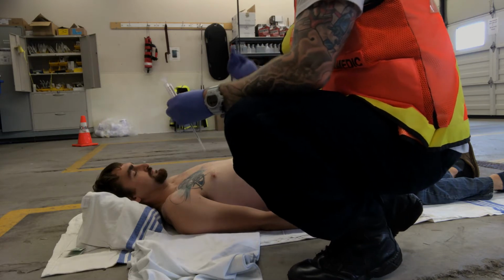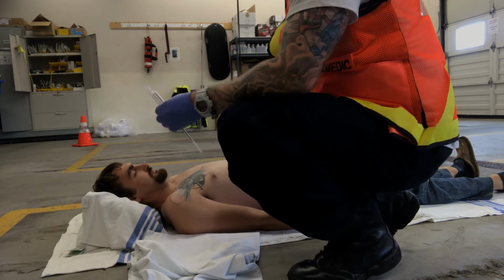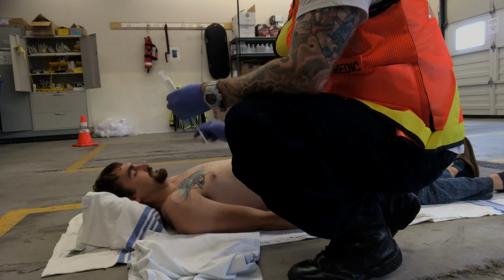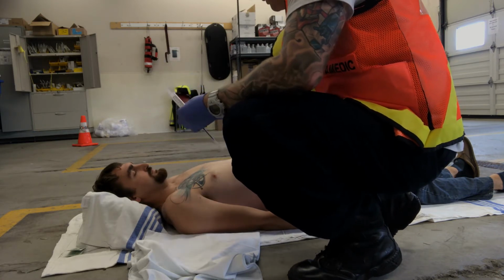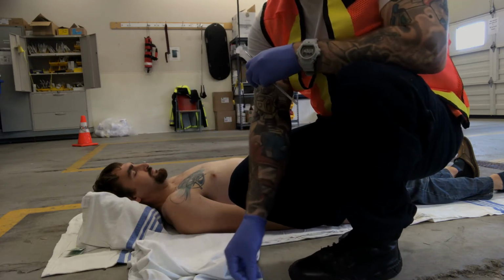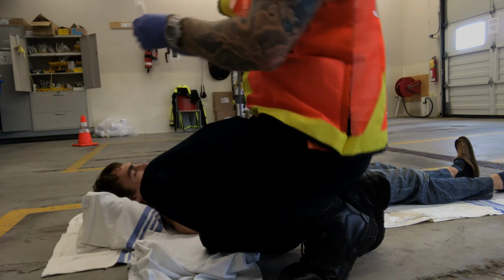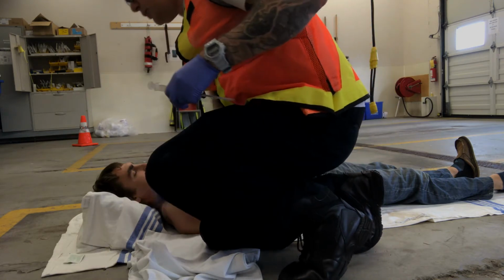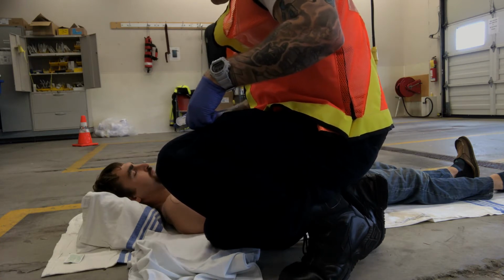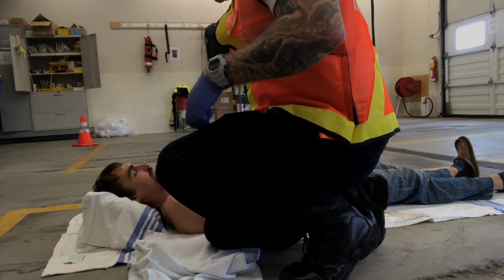After I've assessed, I've seen that the patient has zero lung sounds from apices to bases on the right side, in addition to tracheal deviation, and he is hypotensive and dyspneic, respirating at 30 breaths per minute, labored. Since this is an emergency procedure, I am not going to give analgesic prior to this. The patient is, for the sake of this assessment, unconscious.